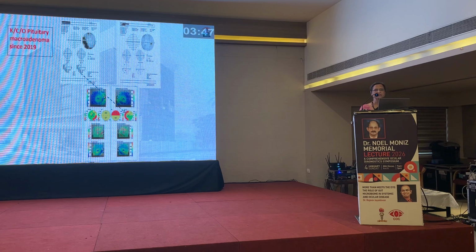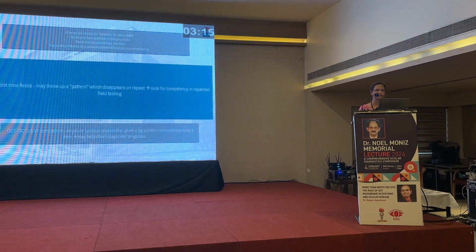This in itself is enough for us to advise that the decision to operate has to be taken for this patient now. Also, in addition, we find that in the other eye there is also a GCC thinning on the nasal side. Perhaps it is a bitemporal field defect in evolution. So this made the decision to operate easier. That is, it reinforced the decision. The patient did undergo surgery after this examination.